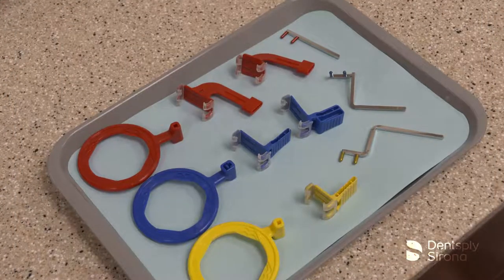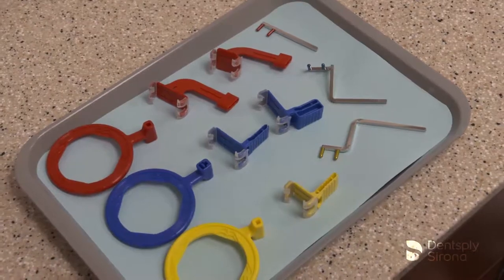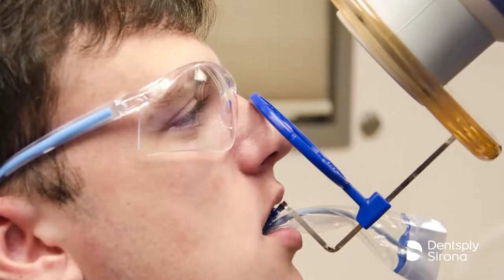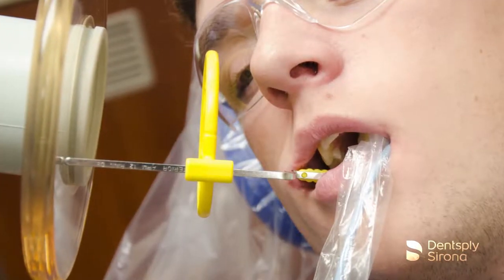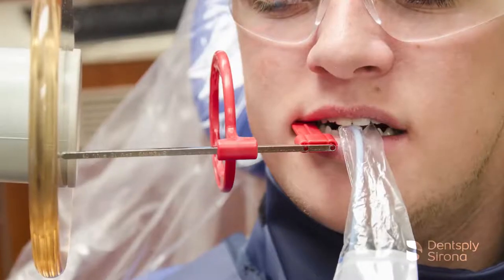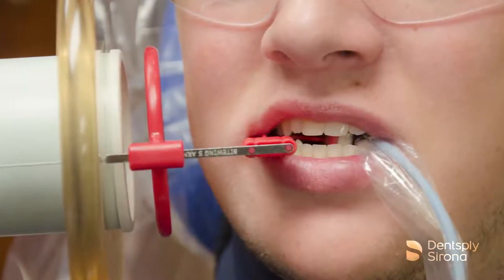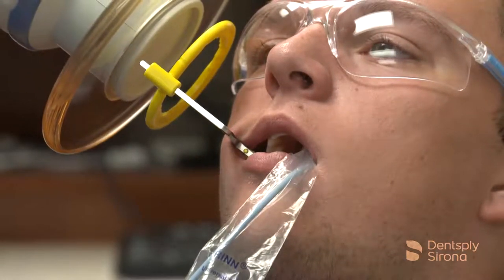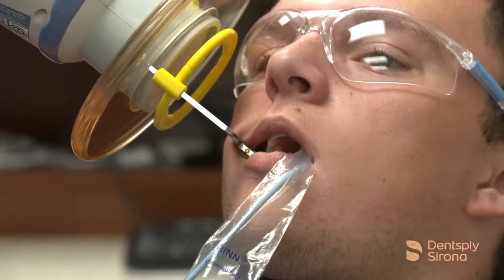Rinn's XCP short arm aiming devices were designed for use with handheld portable x-ray units. The XCP short arms are up to 48% shorter than Rinn's standard XCP arms, enabling closer positioning to the patient's face. Using the XCP short arm makes it easier and faster for the clinician to align the handheld x-ray unit accurately than if an aiming system wasn't utilized.